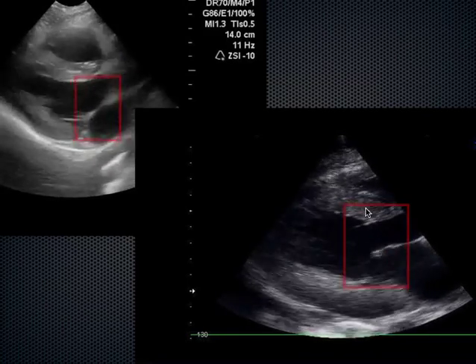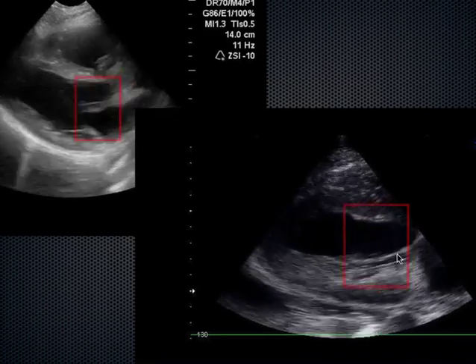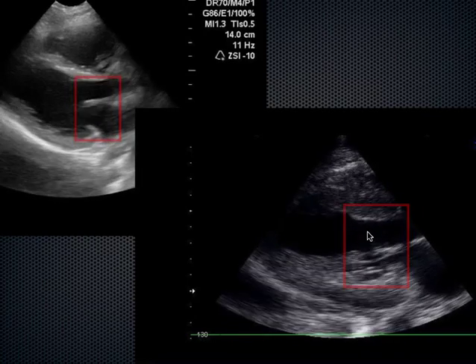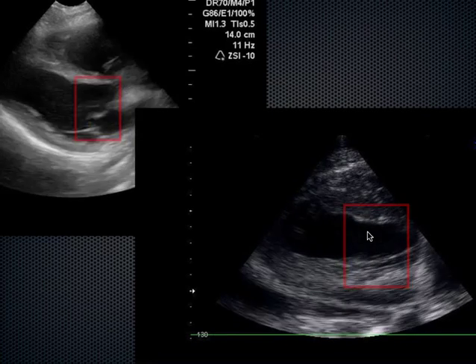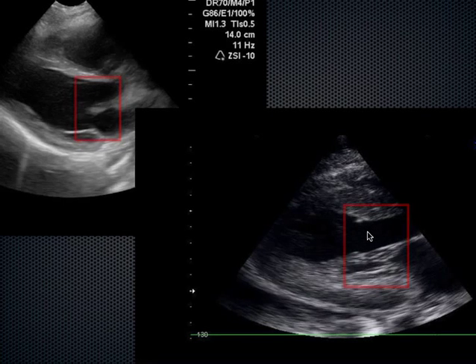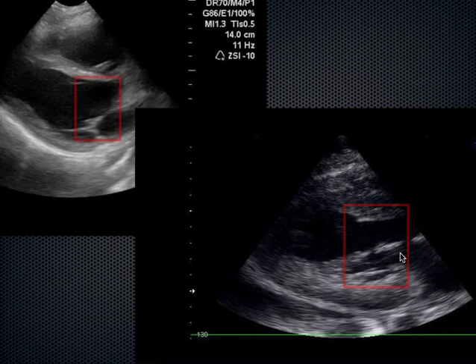One of them is quite abnormal, and the other one is normal. And I think it's probably pretty easy for you to see that this mitral valve here is actually not coming up and smacking into that septum at all. And you can see, even as I freeze the image and back it up, it's really not making any meaningful headway. This is about as far as it gets, not even halfway across this opening to make its way towards the septum.